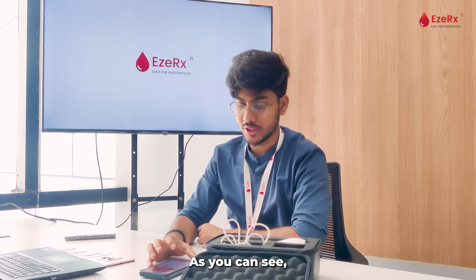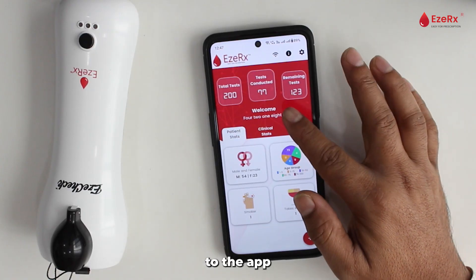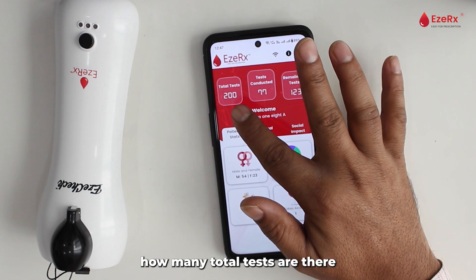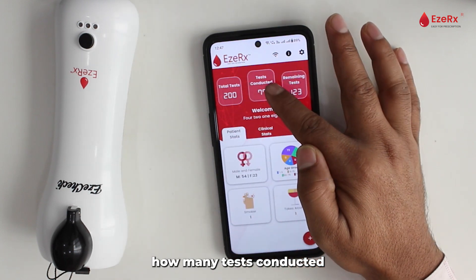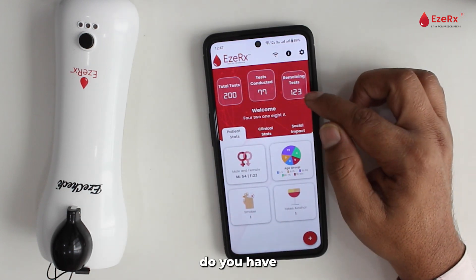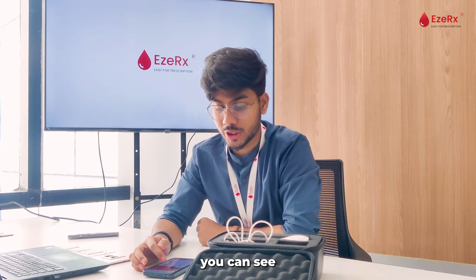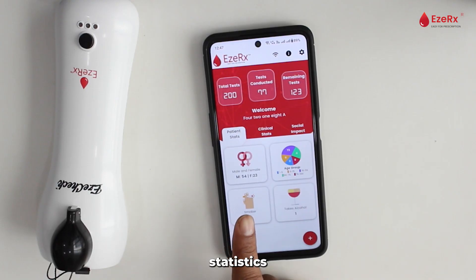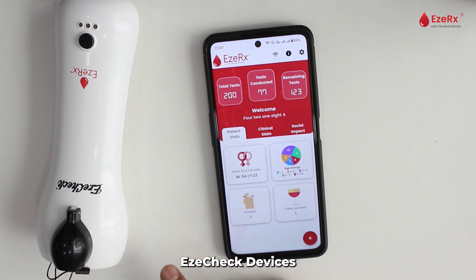As you can see, I have logged in to the app, and I can see how many total tests there are, how many tests have been conducted, and how many remaining tests I have. You can also see the patient statistics, the clinical statistics, and the social impact created by EZ Check devices.